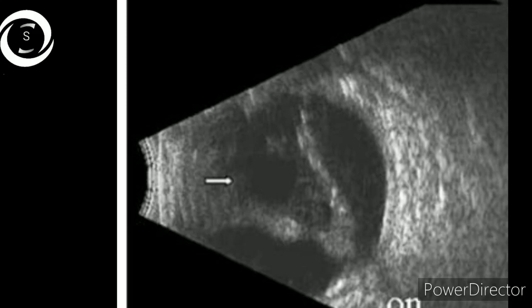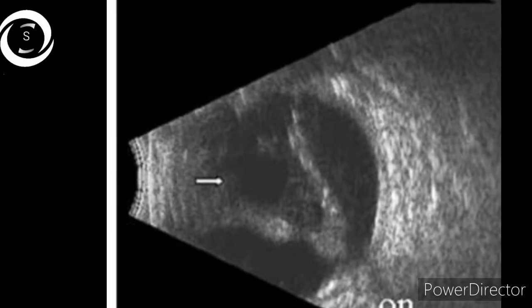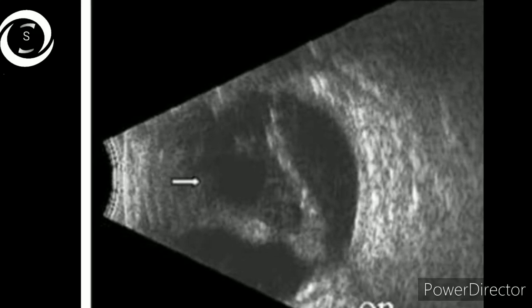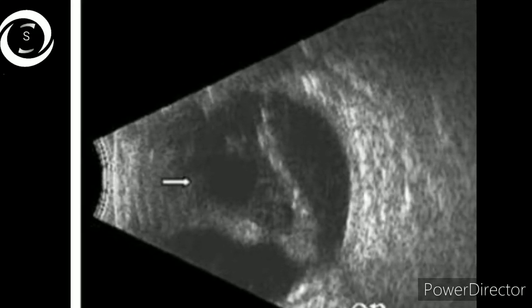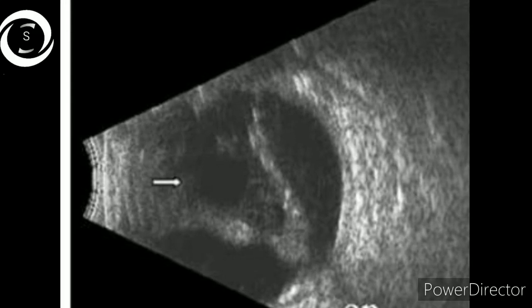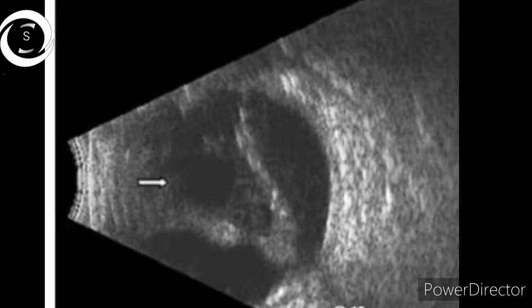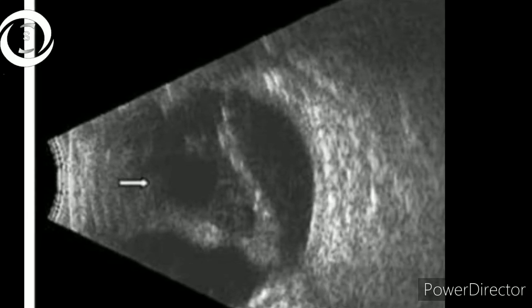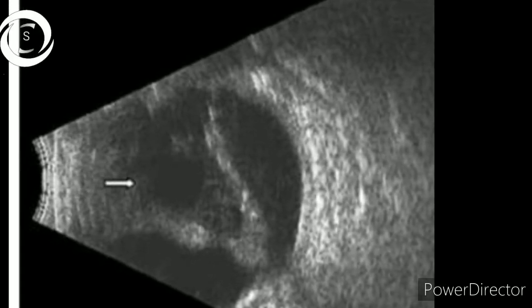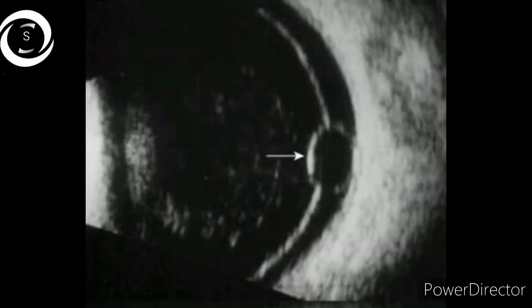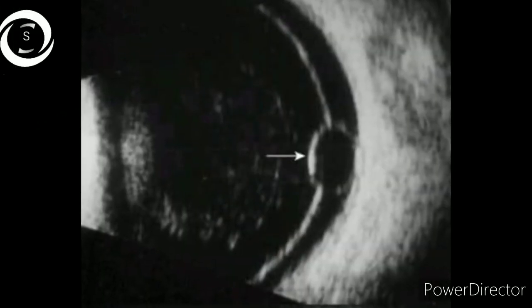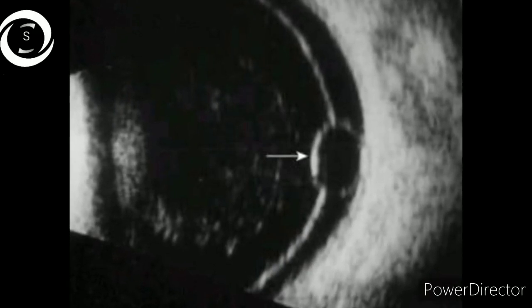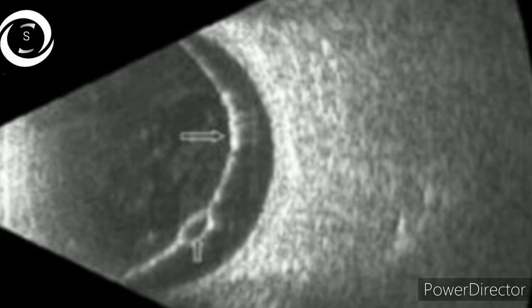You can appreciate the white arrow pointing towards a circular hypoechoic area — that is a vitreous cyst in the vitreous cavity. Compare that with retinal cysts in the coming B scans. A retinal cyst is hypoechoic but surrounded by a hyperechoic covering.